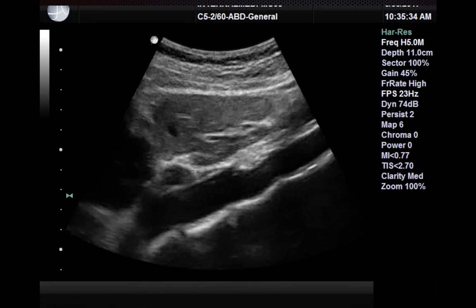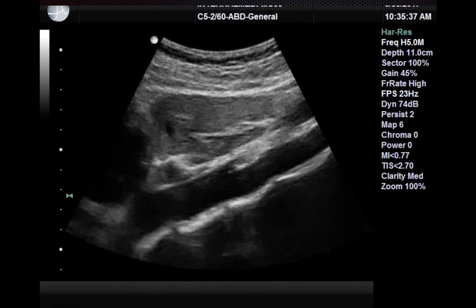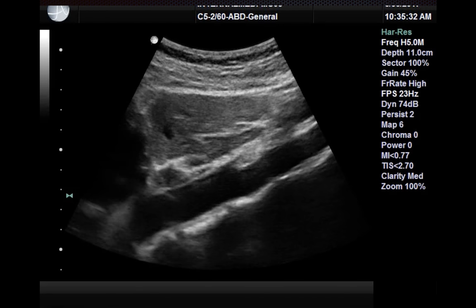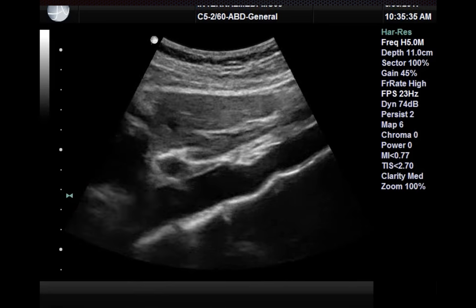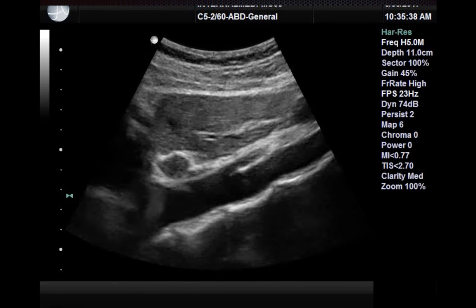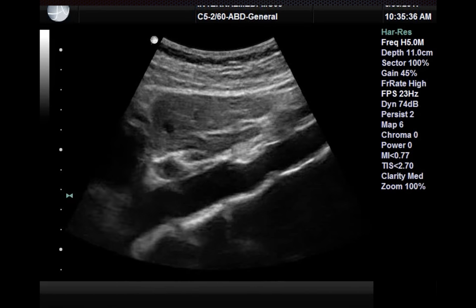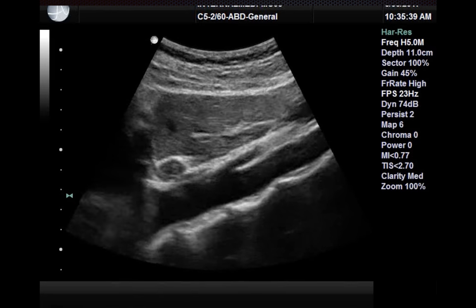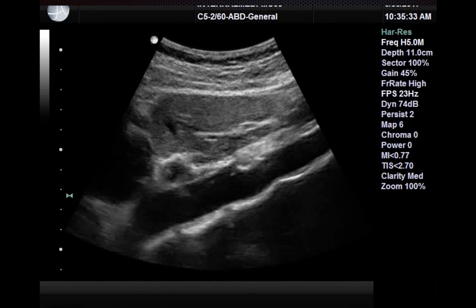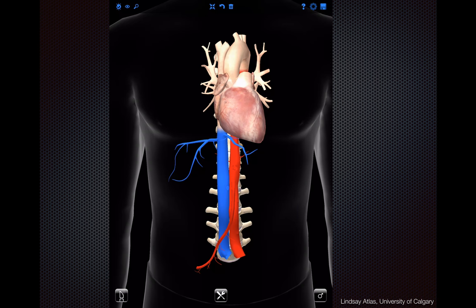It's really important not to start measuring the wrong tube. In this clip, the tube we're looking at is actually the aorta, and there's really no point in doing your measurements here if you're trying to estimate right atrial pressure. So how do we know that this is the aorta as opposed to the IVC? There are a number of ways. The IVC is right of midline on the patient, whereas the aorta is a little bit left of midline. So where you place your transducer should give you a clue as to what tube you're actually measuring.